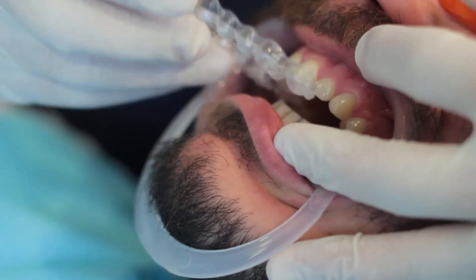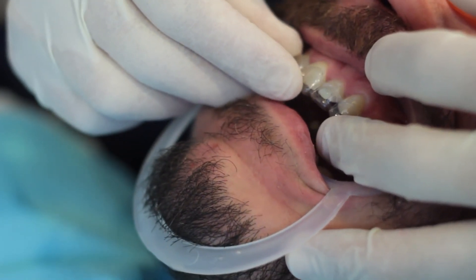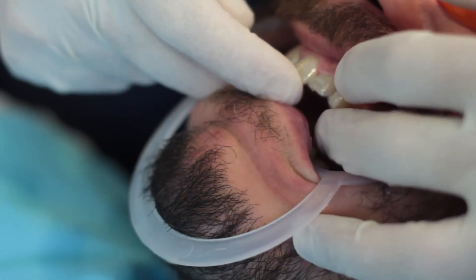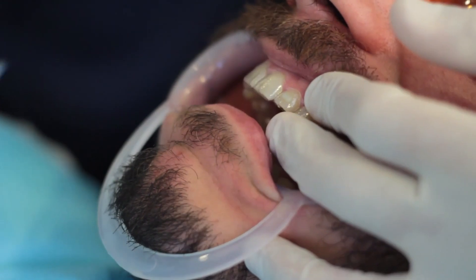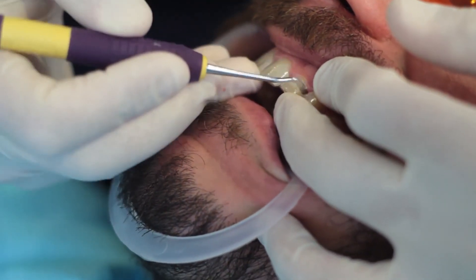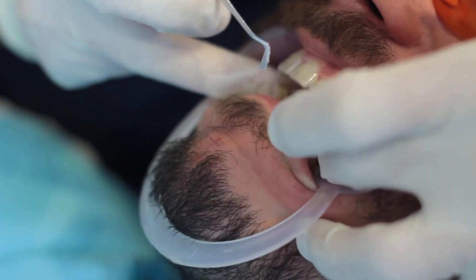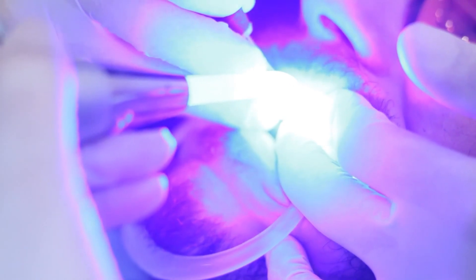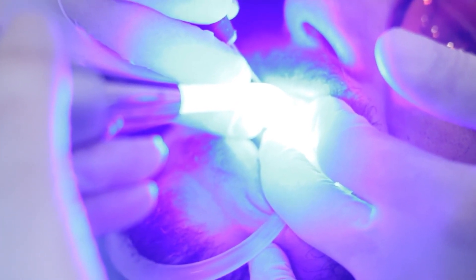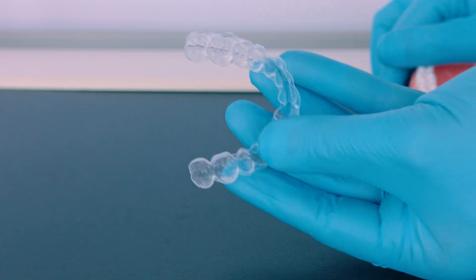Now, place the attachment template filled with composite material onto the patient's teeth. Ensure it fits well by applying gentle finger pressure or asking the patient to bite on a cotton roll. You can even use a dental instrument like a probe or tweezers to apply pressure and make sure each attachment is properly adapted to the tooth. Follow the manufacturer's instructions to light cure the composite material. Start curing from the most posterior tooth where moisture control is a bit more challenging. Carefully remove the attachment template and inspect each attachment.